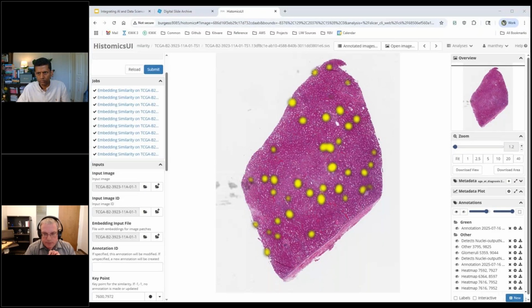We've seen cases where people have OME-TIFF, which is a standard that someone's published, and people have miswritten OME-TIFF, so it's almost to the standard but not quite, and they've stuck their metadata in a non-standard spot. And so then you have to say, can we automatically do that? If it's in the standard spot, we're not bad at it. If you're in a non-standard spot, well, you have to customize that.